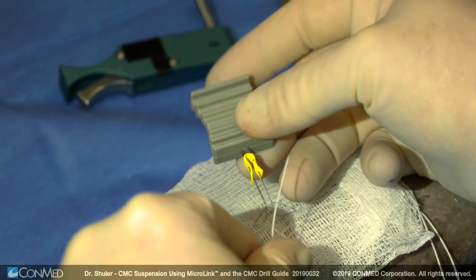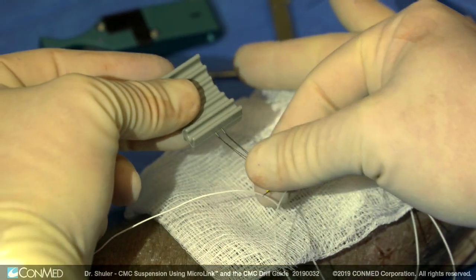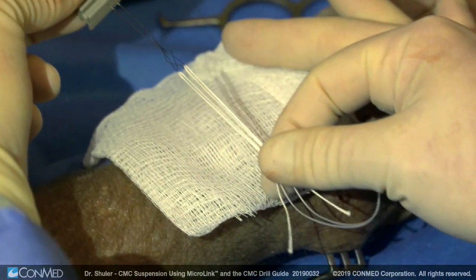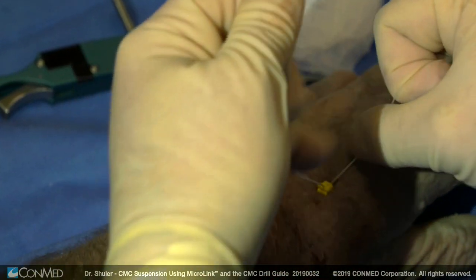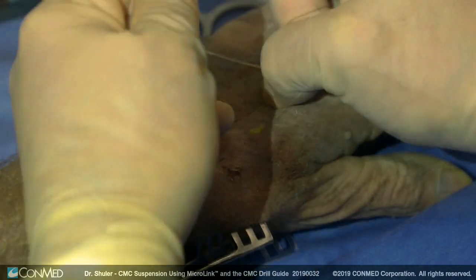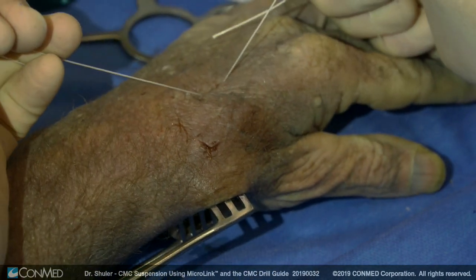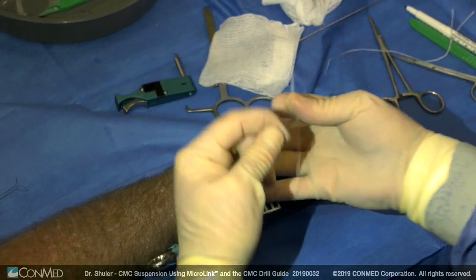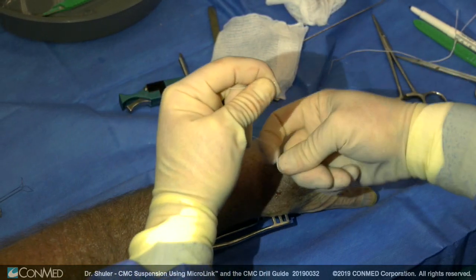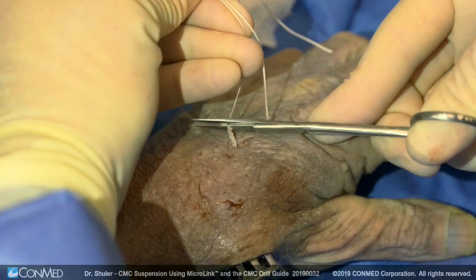Next, the spliced end is cut, allowing for the two number two suture arms to be passed through the loader, where the backstop is then placed down the two arms of the suture bridge. Pulling the suture apart allows passage of the backstop underneath the skin.